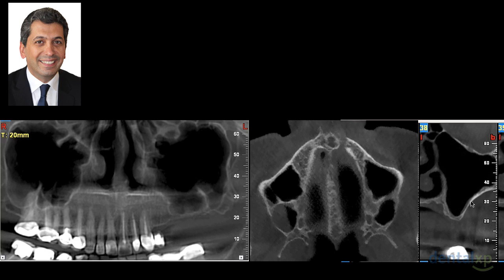When we look at this cut, you can see that we have no residual ridge, almost 1 millimeter, so it will be impossible for us to place the implant immediately. This will be a delayed implant placement, so we will only graft the sinus. You see that we have more or less a 2 millimeter thickness of the bone, so we may have to scrape this bone a little bit in order to make it thinner before we can start cutting it.